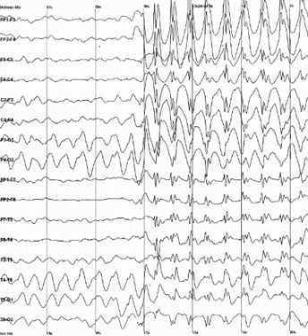Beta is the frequency range from 14 Hz to about 30 Hz. It is seen usually on both sides in symmetrical distribution and is most evident frontally. Beta activity is closely linked to motor behavior and is generally attenuated during active movements. Low amplitude beta with multiple and varying frequencies is often associated with active, busy or anxious thinking and active concentration. Rhythmic beta with a dominant set of frequencies is associated with various pathologies, such as DUP15Q syndrome, and drug effects, especially benzodiazepines. It may be absent or reduced in areas of cortical damage. It is the dominant rhythm in patients who are alert or anxious or who have their eyes open.